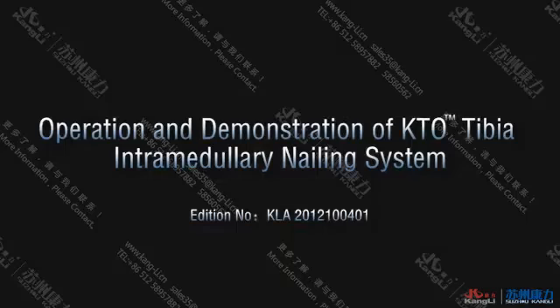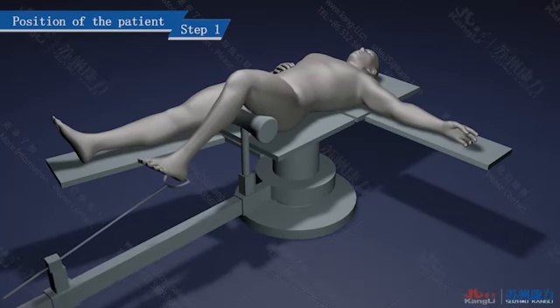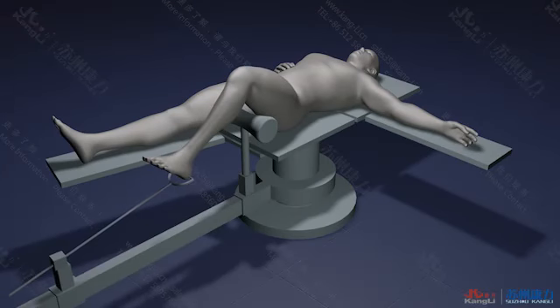Operation and demonstration of KTO Tibial intramedullary nailing system. Step 1. Position of the patient. Place the patient on the fluoroscopic operation bed in supine position. The injured knee joint should flex at least 90 degrees to 100 degrees for the insertion of the nail. Perform traction reduction for the fracture, and when satisfied, fix it on the orthopedic bed.